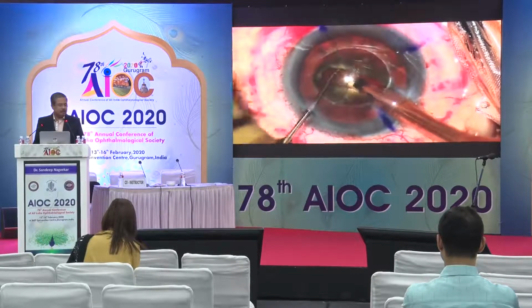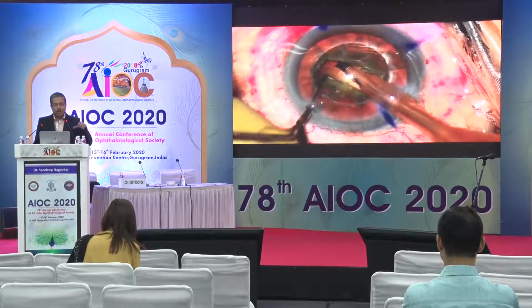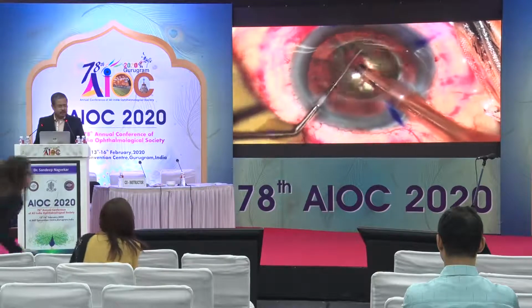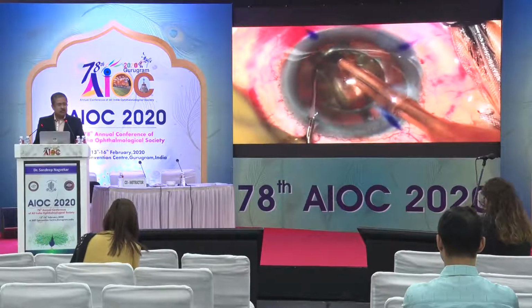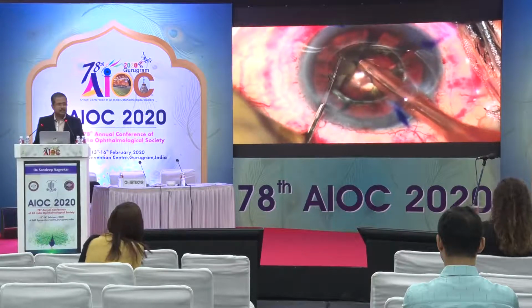You like to make a wide trench so that as you're going in, the tip along with the sleeve can get to the bottom. Splitting, once you are able to go down right to the posterior edge, is quite simple. This is a case of a femto. So as you can see, those planes of cleavage have already been created. This ensures that perfect separation takes place.